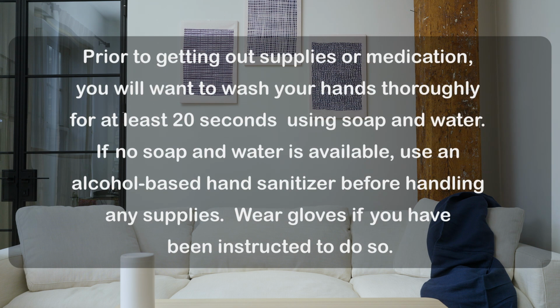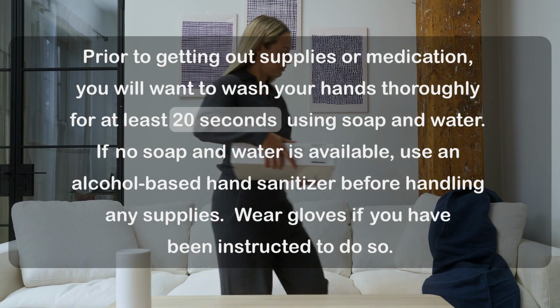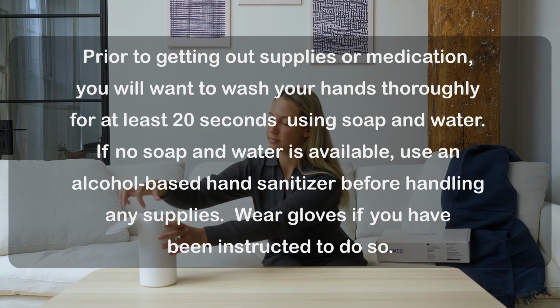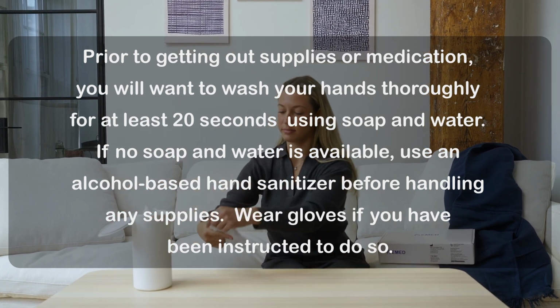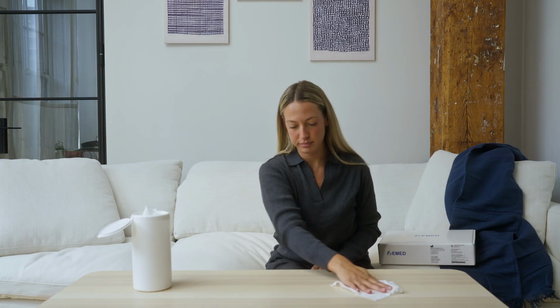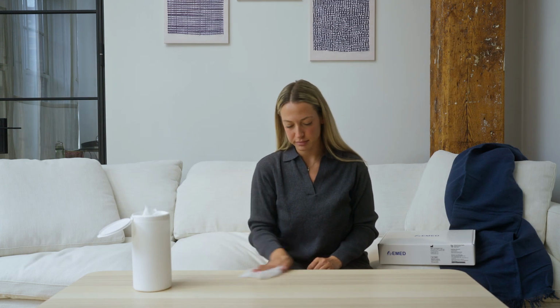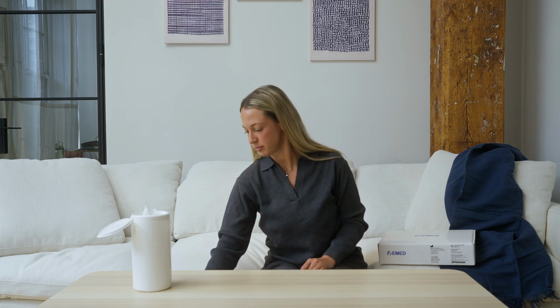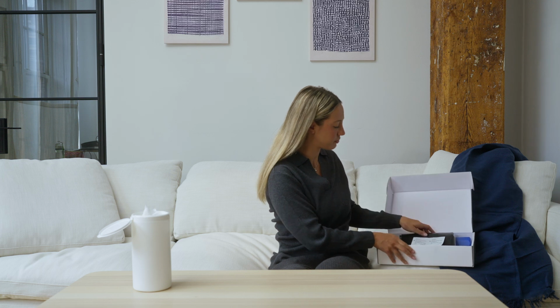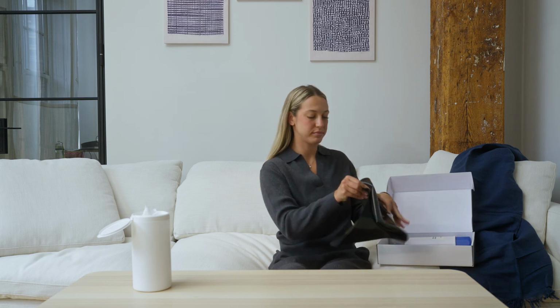Prior to getting out supplies or medication, you will want to wash your hands thoroughly for at least 20 seconds using soap and water. If no soap and water is available, use an alcohol-based hand sanitizer before handling any supplies. Wear gloves if you have been instructed to do so. You will want to disinfect your work surface prior to laying down any supplies or medications. You will now want to place all supplies onto your prep mat or clean work surface.